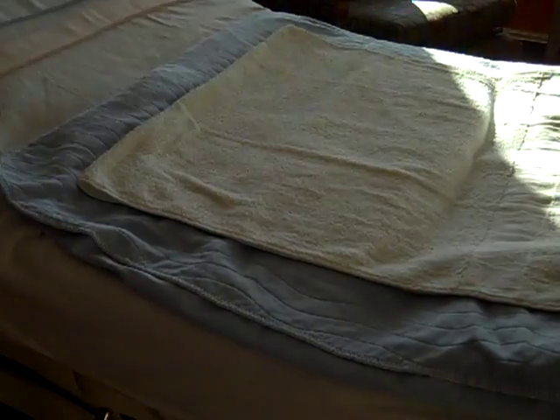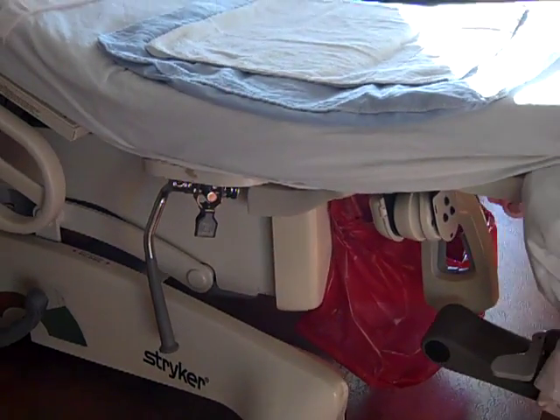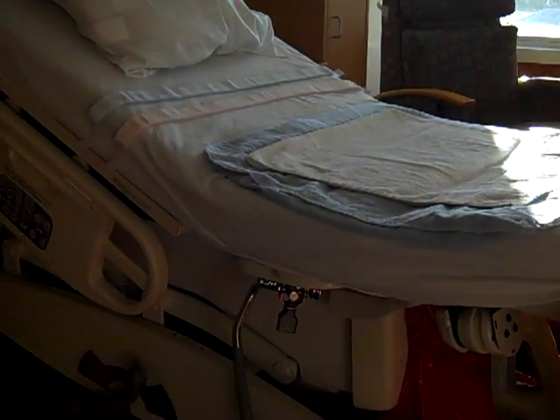The stirrups come up from underneath and they are lifted up and the patient's legs are placed there. After the use, those are easily placed back under the bed so that the patient can be in a regular bed type situation.